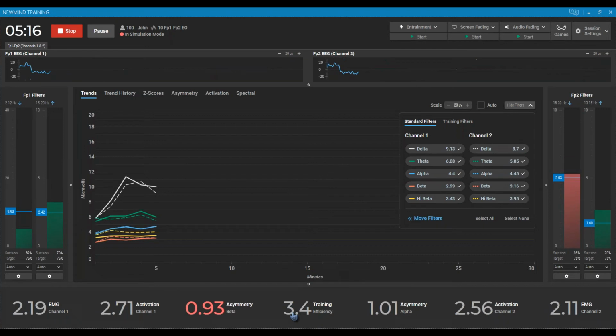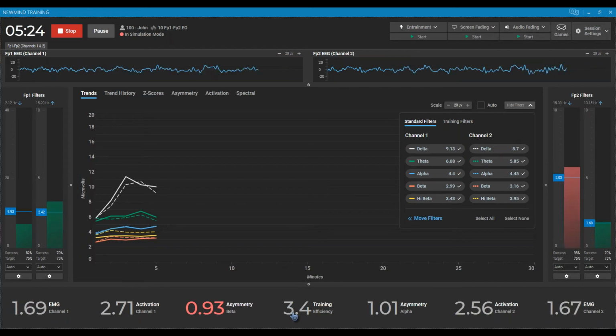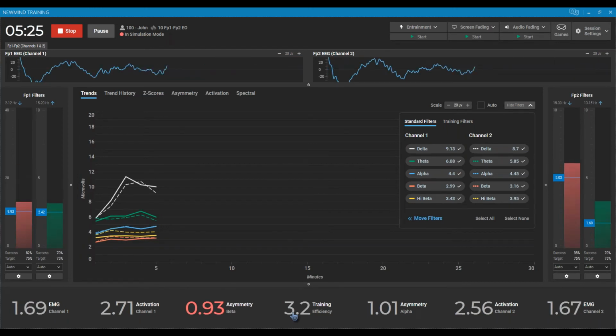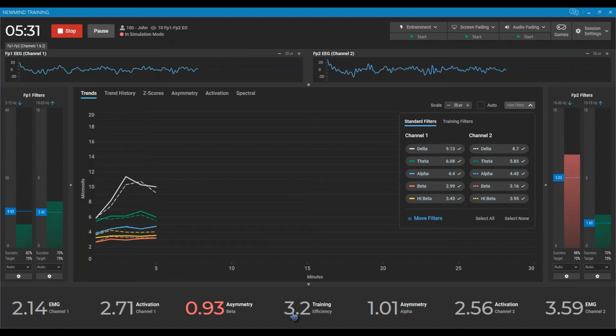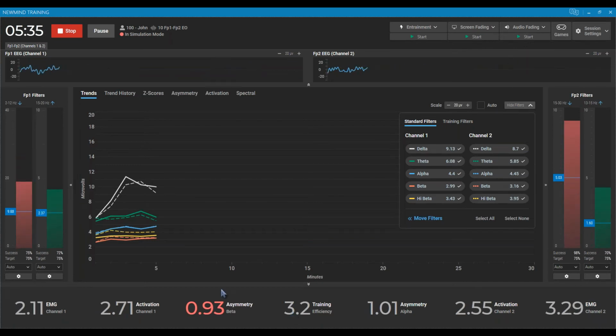So that's where I think adjusting that threshold, if I can chime in there, Aaron, the default setting for the NewMind software is 75% threshold. So if you start a session with that and you're in a one-channel session and it's down, say, below 50, it might be that it's a bit too hard.